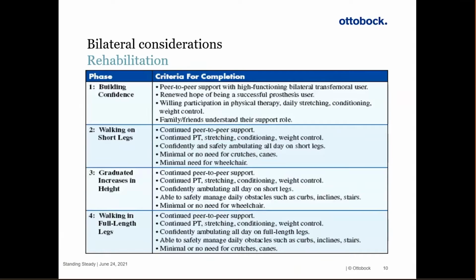Graduated increases in height will come later as the user shows that they can ambulate very well on their stubbies. There are times that people don't get stubbies at all, but sometimes going back to that can also be helpful so that they gain that core stability and strength, and then ultimately walking on full-length legs.